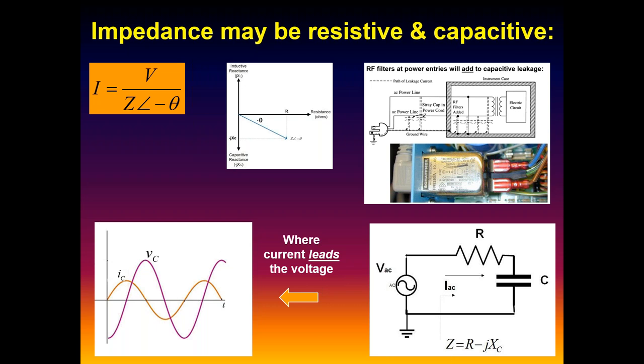The AC line, if you ever had a chance to look at this, we rented analyzers every now and then, real expensive analyzers, to monitor our power. There is all kinds of garbage flying on a normal AC line. Have you ever looked at that? You see in our books it's all pretty clean sine waves, but there's all kinds of garbage flying on it, really high speed transients and just junk on our incoming power line. Well, those filters are designed to filter some of that out, as well as prevent the device from injecting garbage back on the power line. So it works both ways.